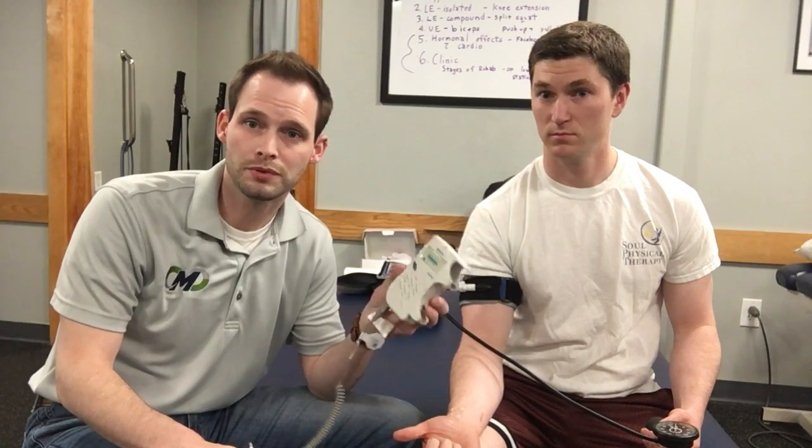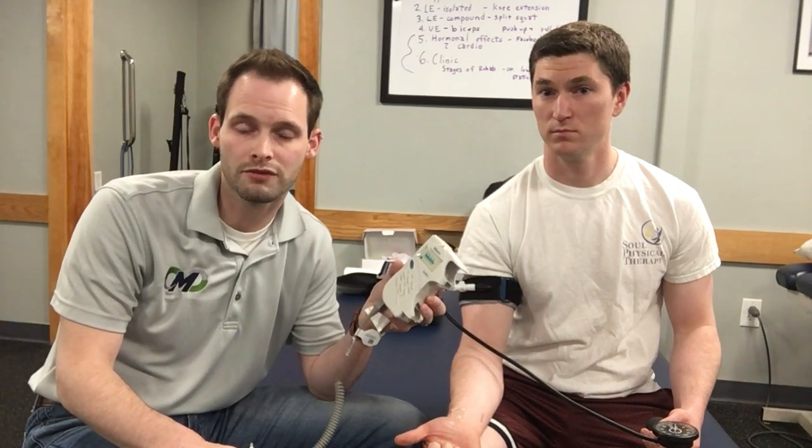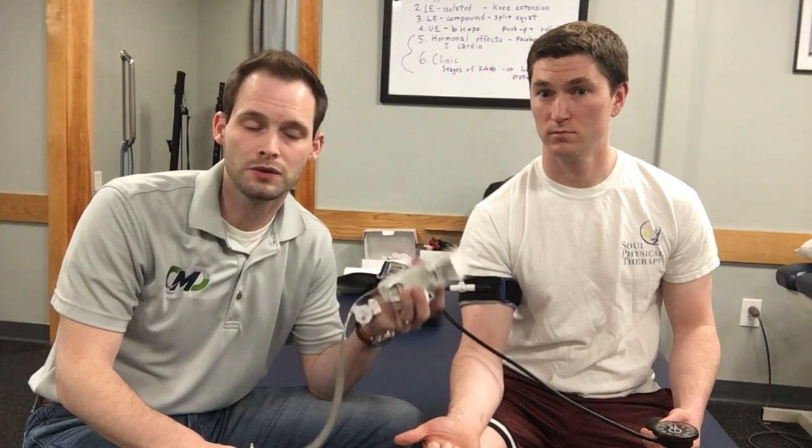These units are very easy to come by and very cheap — this one is roughly around $100 on average. We utilize this with the cuff to find the limb occlusion pressure, which is a really individualized pressure for when blood flow will stop going through. Remember, blood flow restriction training is not occlusion training — it's restricting some of the venous return, so we really want to make sure that we're still having some arterial blood flow.